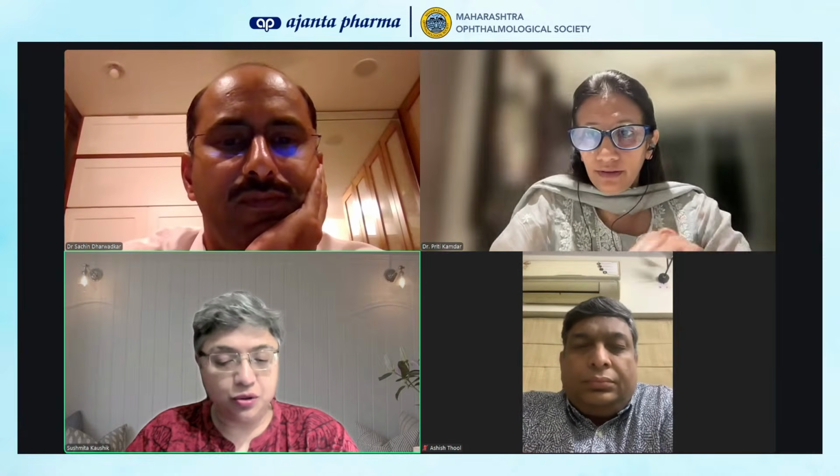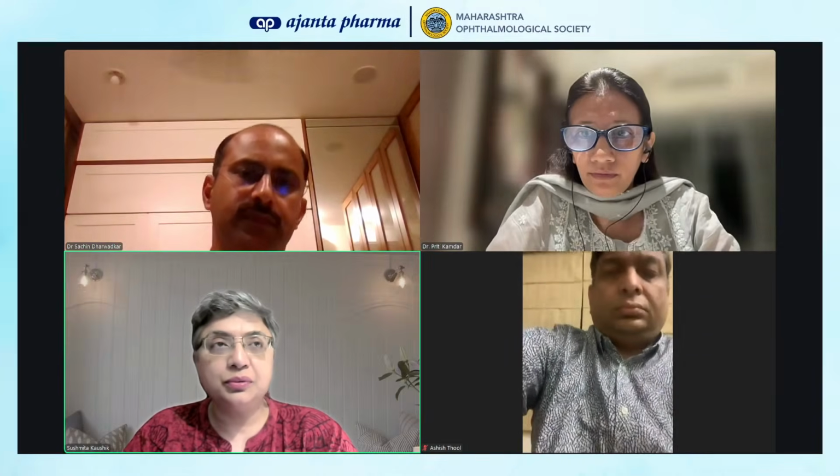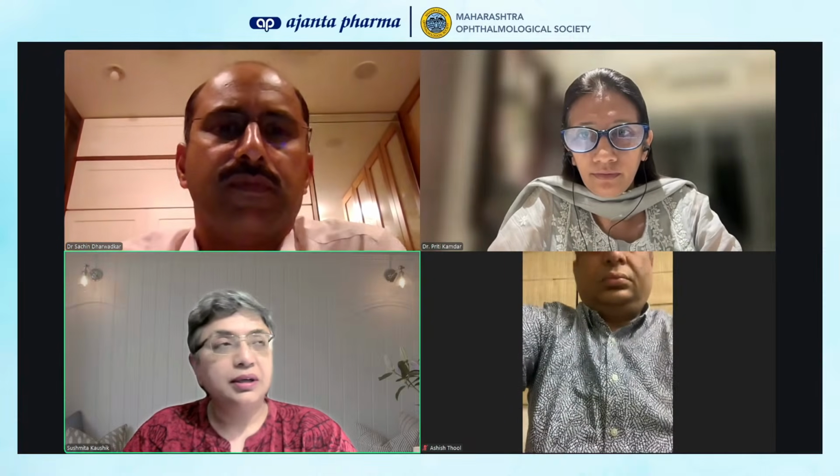So what about you? I do them all together because I don't think it's true that the macular ganglion cell loss would precede the RNFL. That's how it was touted when the machine came. It's important to understand that it's the topography of the defect which will allow you to pick up the defects on the macular or the RNFL.